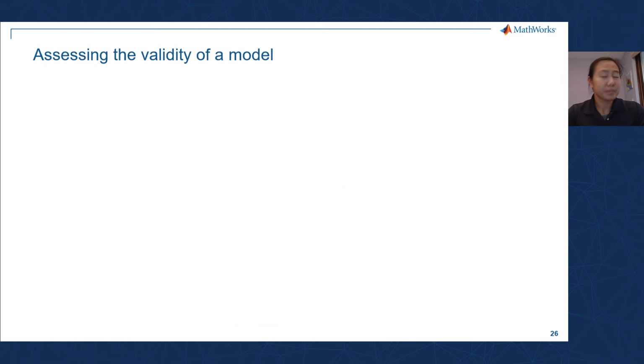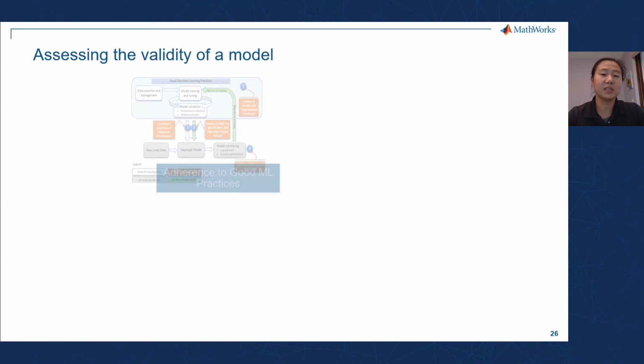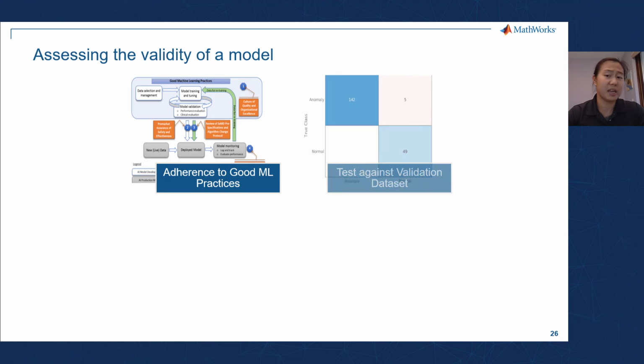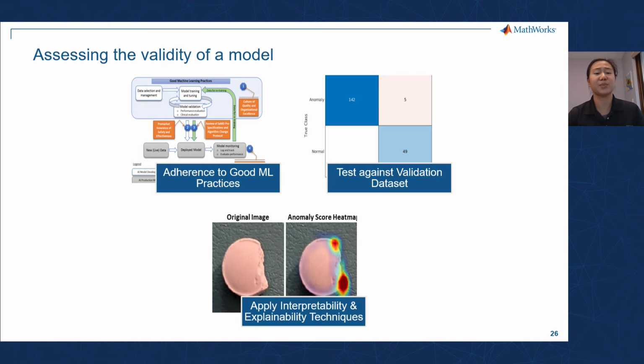All right, so I'll go over this topic very, very quickly. But essentially, I wanted to spend a little bit of time talking about how to validate an AI model, because it is a question that has been coming up a lot among my medical device customers. It's becoming a very, very critical step in preparing for eventual submission for FDA approval, for example.